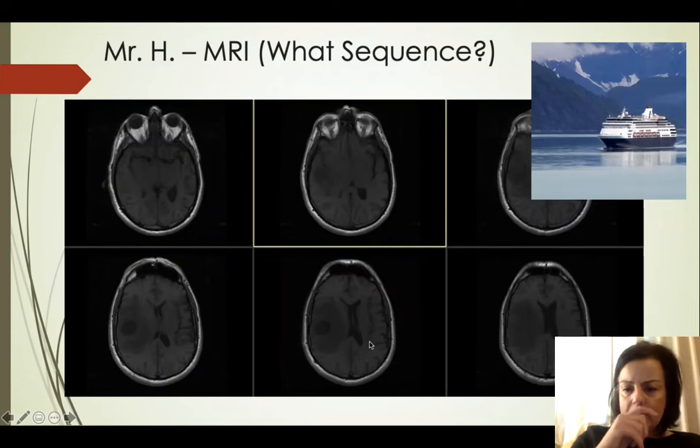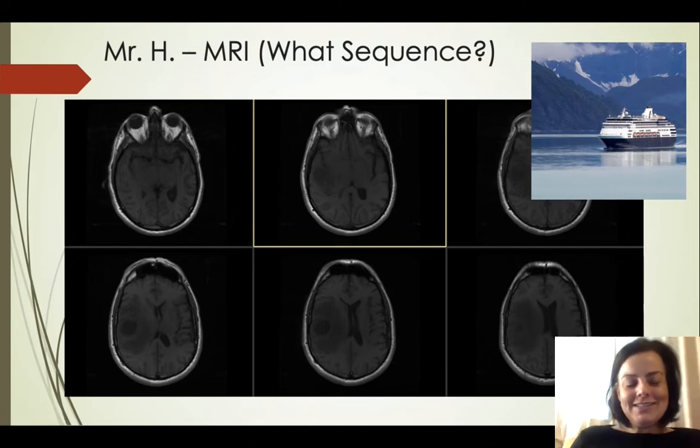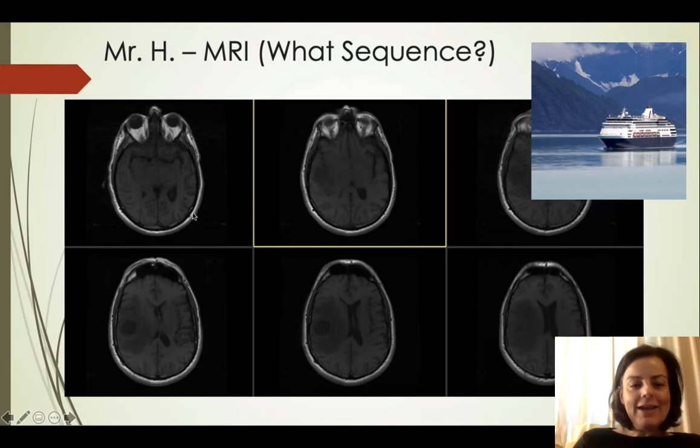Okay, so we're going to go through MRI, back to these three patients. This is the gentleman that had something in his right hemisphere. You remember this. So here's his MRI, and again, it can be easy to mistake one type of study for another. It gets kind of confusing. You're looking at all these things in a dark room. This is MRI, right? We don't have that bright, thick skull, so that can help you there. And look at the orbits. Look at all the detail we can see on the orbits. So that's a good way to know that you're looking at an MRI.